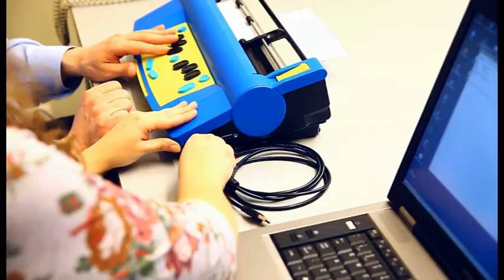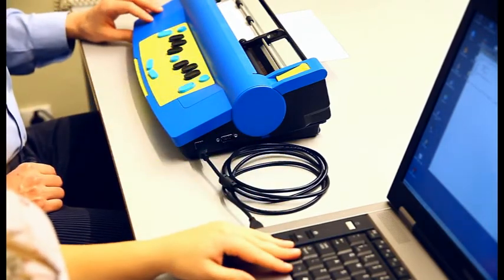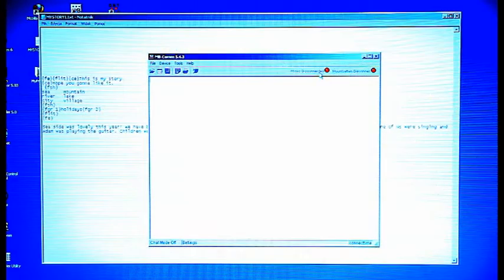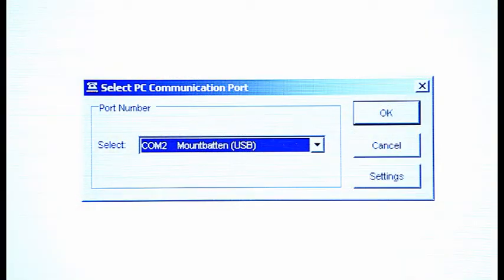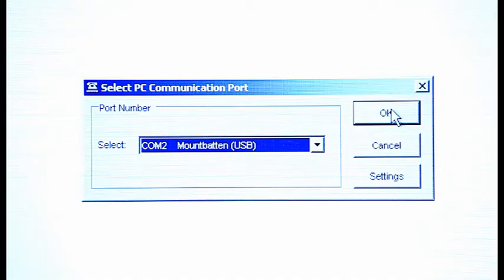The first thing you do is connect the Mountbatten to your PC using a USB cable. Next, turn the Mountbatten on and then run MBCom. To begin communication between MBCom and the Mountbatten, initiate the connection either by pressing the red button in the top right corner of MBCom, or by going to the Device menu and selecting Connect Mountbatten. A dialog box will pop up with information about the COM port your Mountbatten is connected to. Make sure the selection reads COM with a number, Mountbatten USB. Click OK.